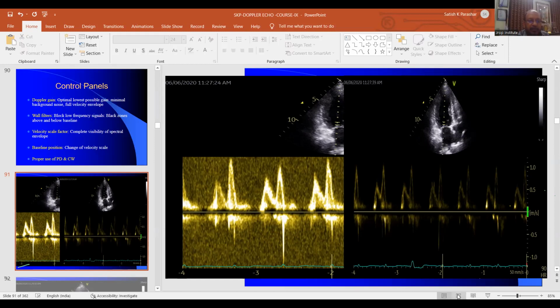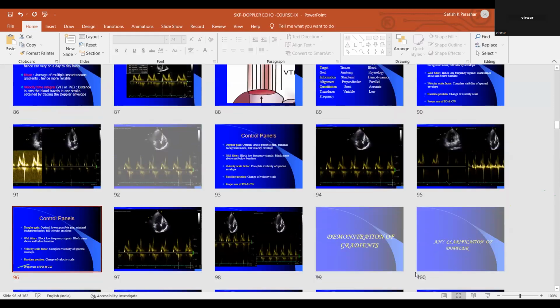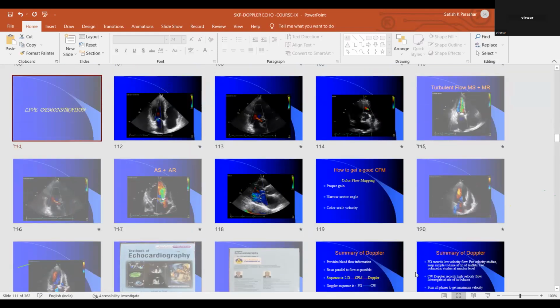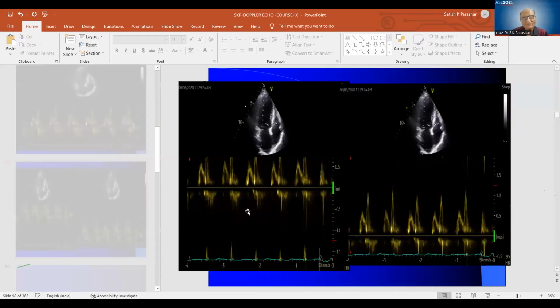Ask the question. Sir, I have a basic question about the Doppler wave, the approach to study Doppler. Can you please revise the concept of approaching Doppler above the baseline or below the baseline? What difference does it make if I plan to study it the opposite way? And what is the difference between the Doppler shift and studying the Doppler wave? This Doppler shift is something different.